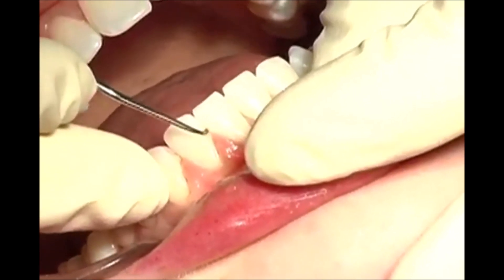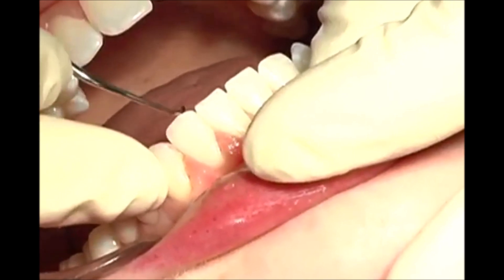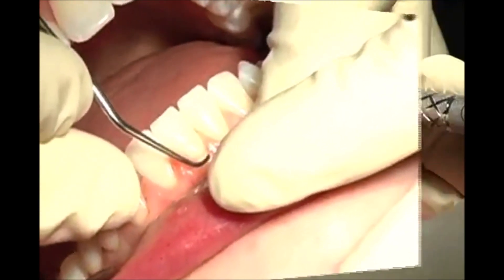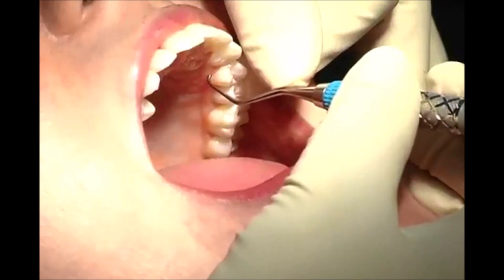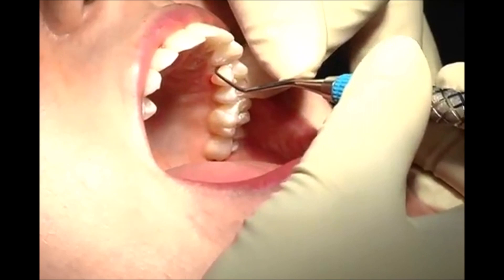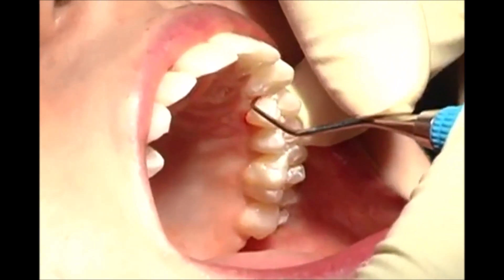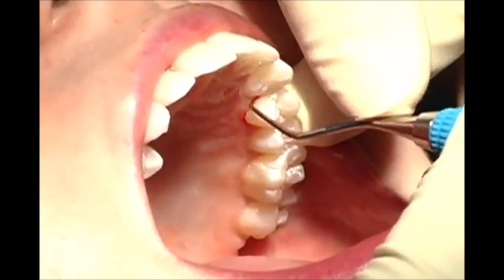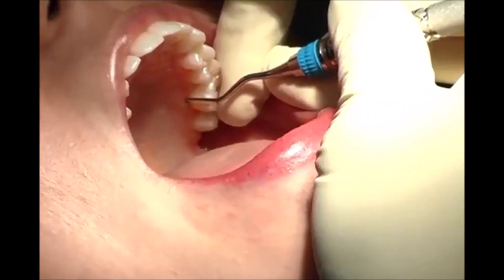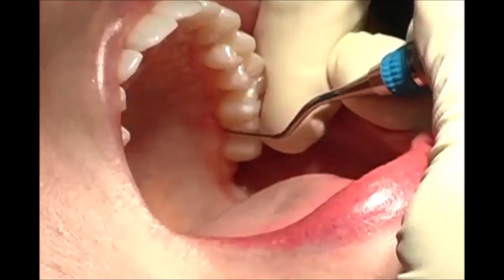The Micro Mini 5 1-2 adapts well to the narrow root anatomy of anterior teeth while reducing traumatic tissue distension. The Micro Mini 7-8 is great for accessing the buccal and lingual aspects efficiently. The Micro Mini 5 11-12 and 13-14 are ideal for accessing molar anatomy with ease.